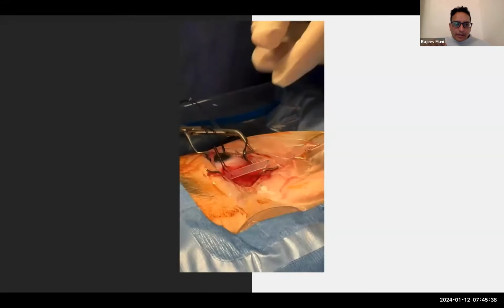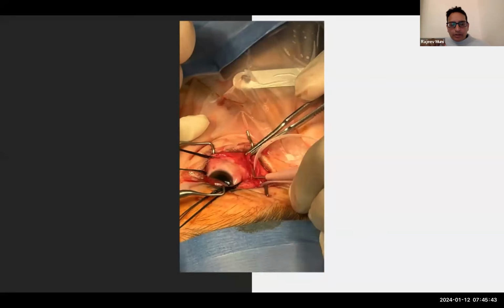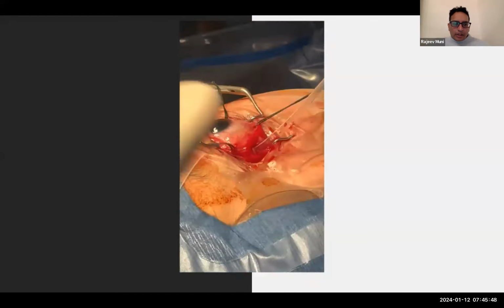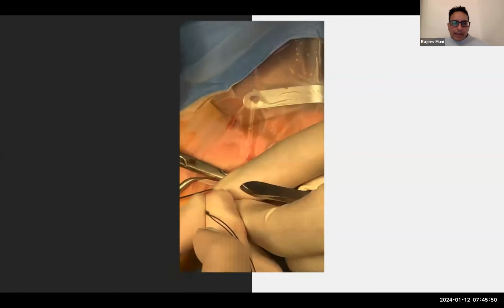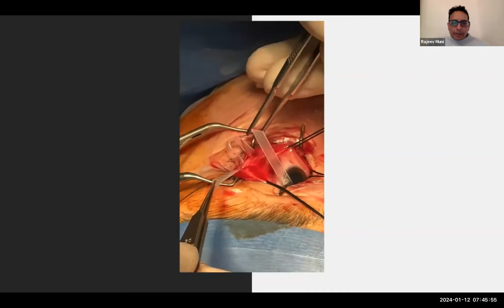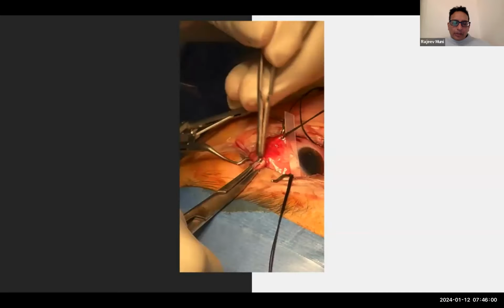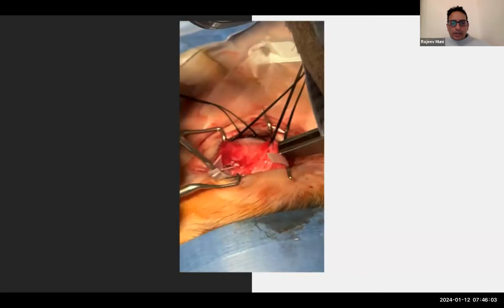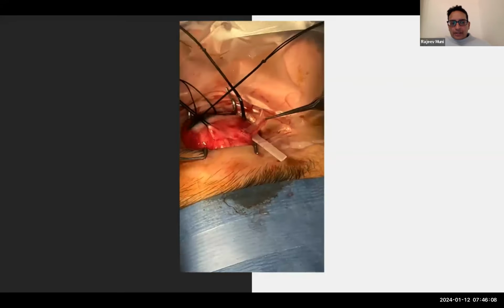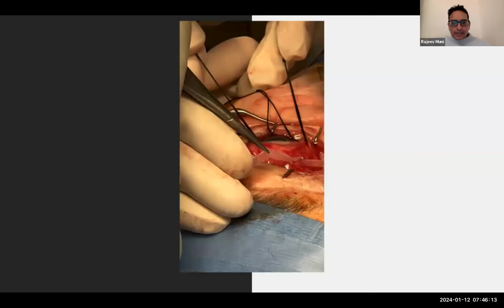And then here you can see we're passing the scleral buckle through each belt loop. And then we are taking essentially a snap and passing it from one radial incision under the muscle to the other radial incision. And then we're passing the buckle around that way. So what we thought was that this would allow you to do an encircling band without opening the conjunctiva significantly, other than the 4 small radial conjunctival incisions.